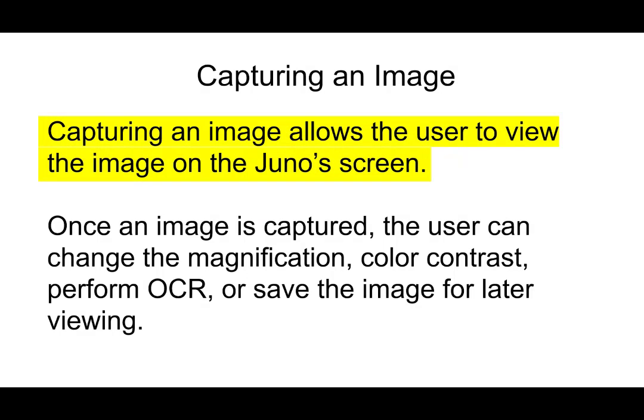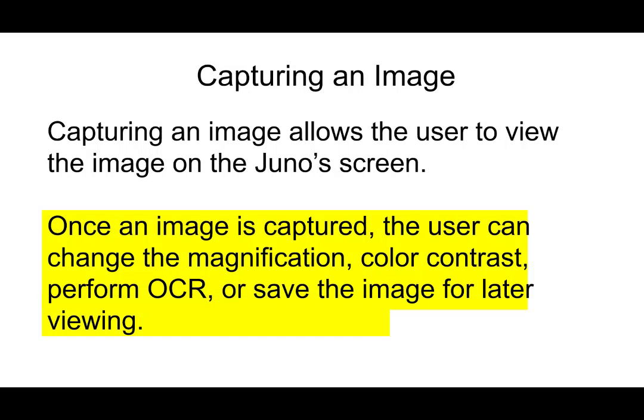So what exactly is capturing an image? Capturing an image allows the user to view the image on the Juno screen, and allows the user to move the Juno away from the image or move it closer to their face or in a position that's easier to view what's on the screen without having to have the item exactly underneath the camera at all times. Once the image is captured, the user can change the magnification, color contrast, they can perform OCR, or they can even save the image for later viewing.